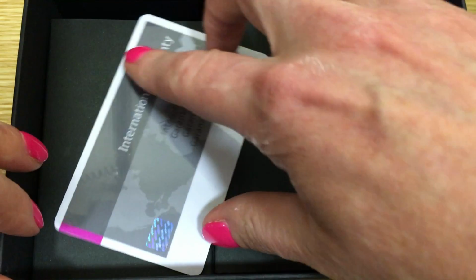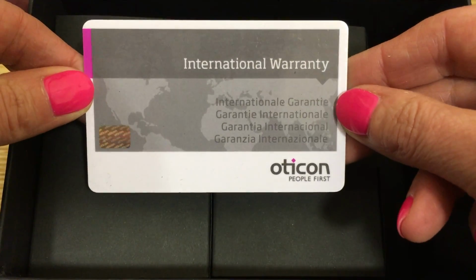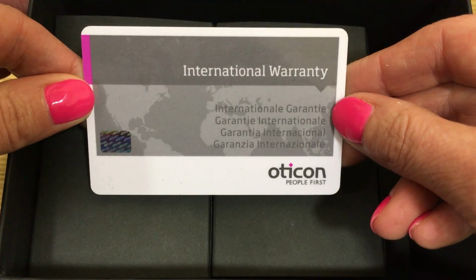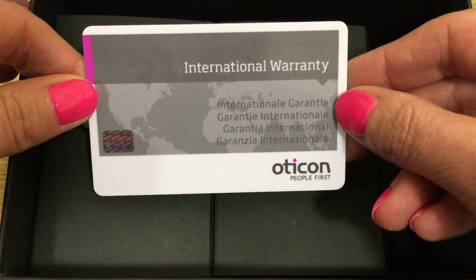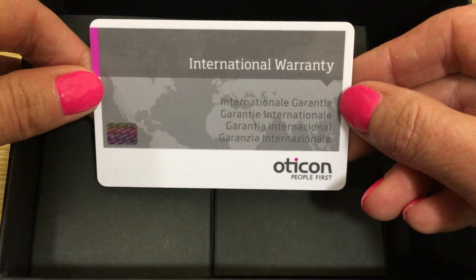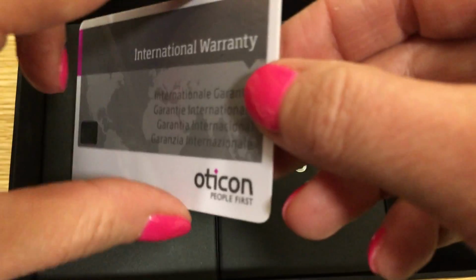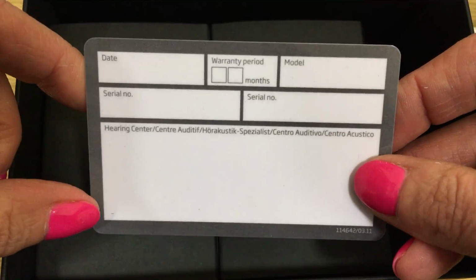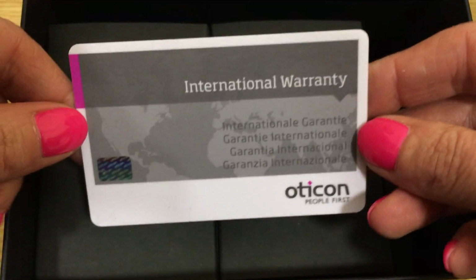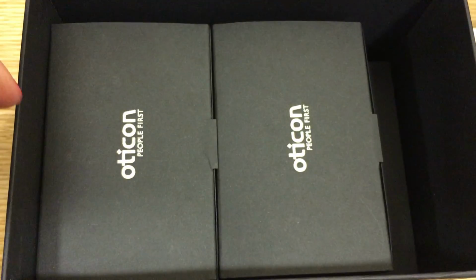The international warranty card. Oticon instruments come with a 2-year warranty. It's an international warranty. That means the instrument can be serviced or repaired anywhere in the world that has an Oticon office. Also, the person does not have to carry this card with them, as the warranty is stored on the chip inside the instrument.